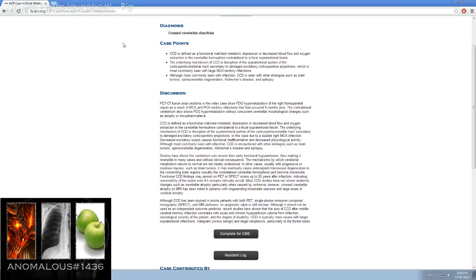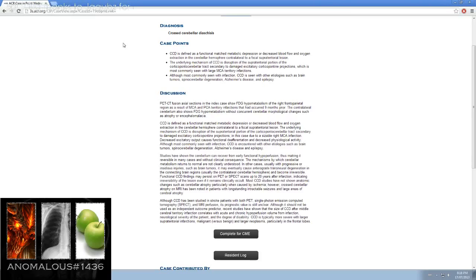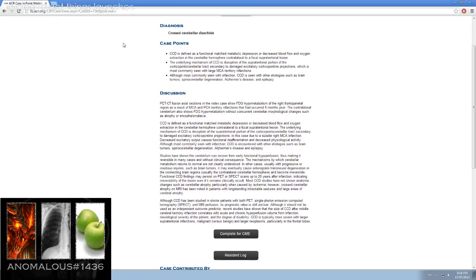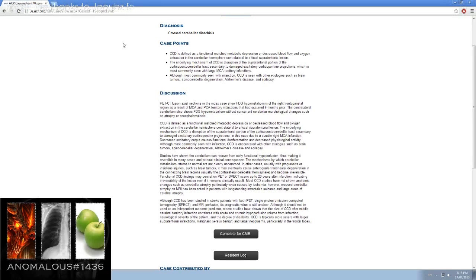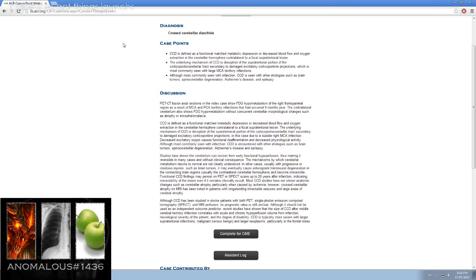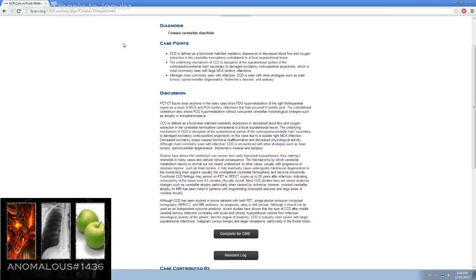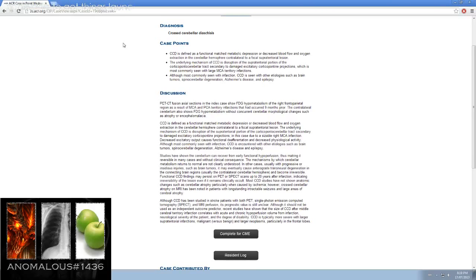CCD is defined as a functional mismatch of metabolic depression or decreased blood flow and oxygen extraction in the cerebellar hemisphere, contralateral to a focal supratentorial lesion. The underlying mechanism of CCD is disruption of the supratentorial portion of the corticopontocerebellar tract, secondary to damaged excitatory corticopontine projections. In this case, due to a sizable right MCA infarction, decreased excitatory output causes functional deafferentation and decreased physiological activity.